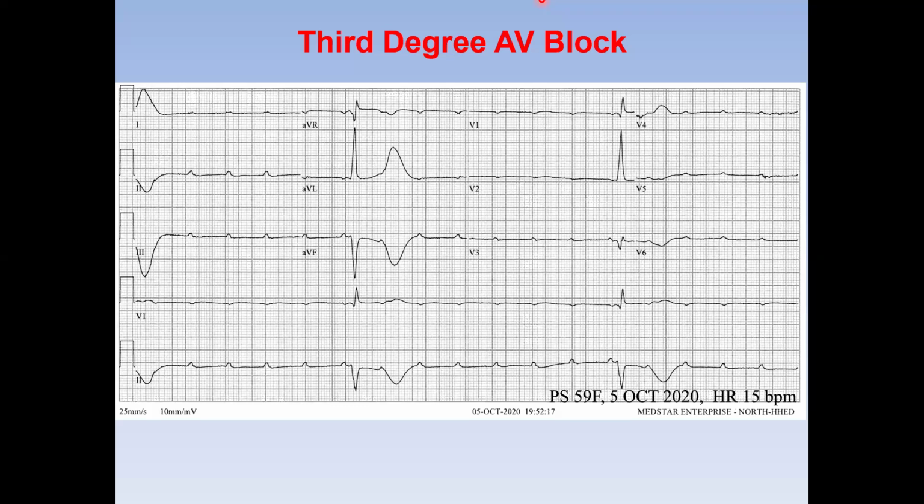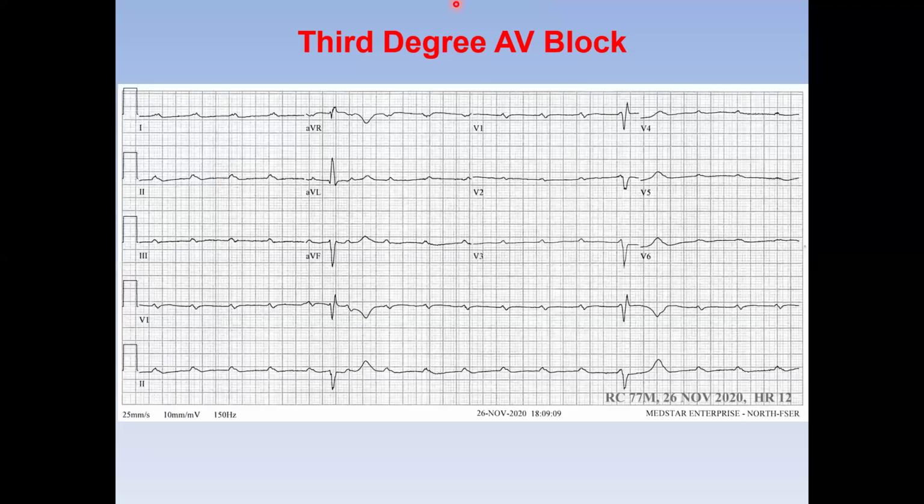It can be that the conduction system is diseased and there is some conduction, and then it gets dinged up, and then conduction recovers. It's just like left bundle. What we used to consider complete left bundle block is actually not complete left bundle block. There is some conduction. So this is another patient.